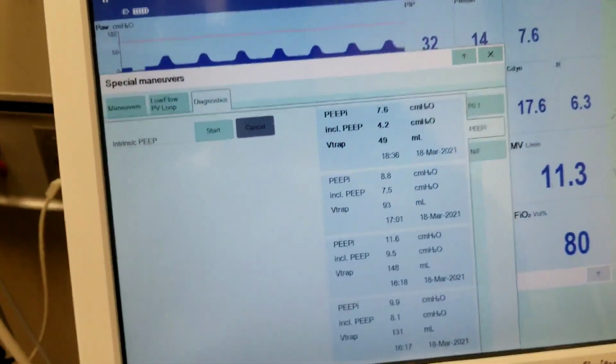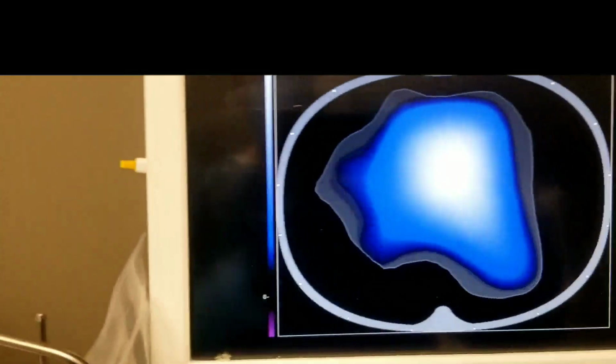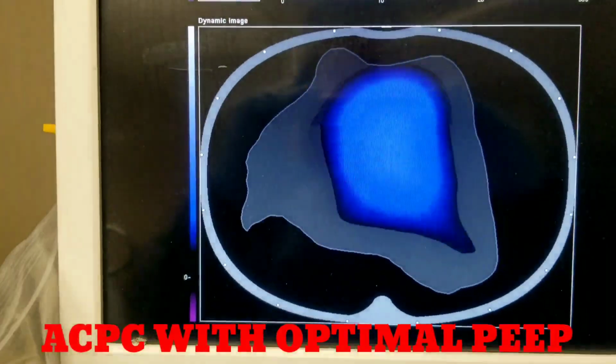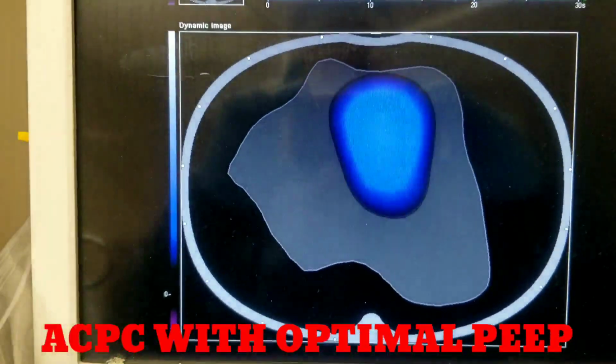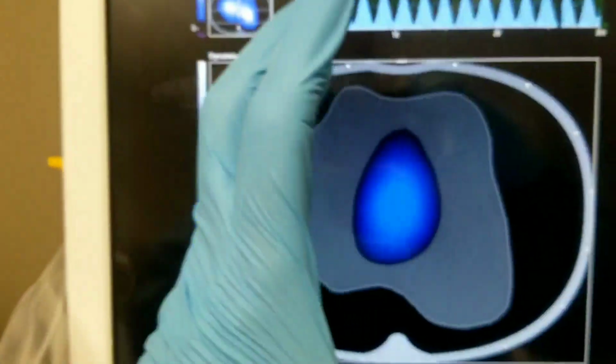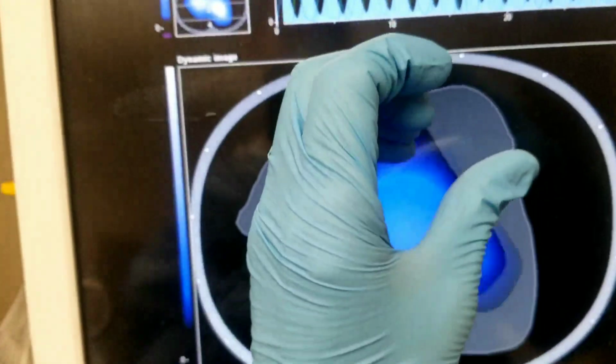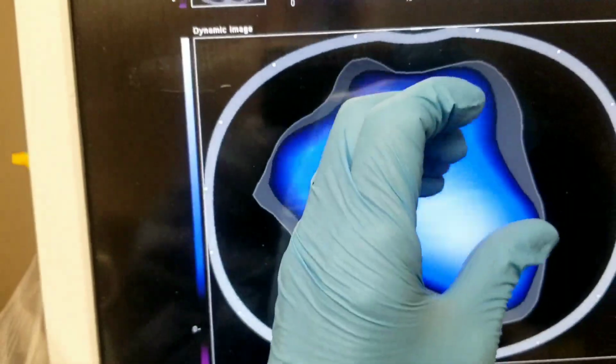We're going to set the patient on a rocuronium infusion. And if you look at here, notice the difference. See how the APRV was really hovering and splinting the lung open, and now on expiration it's going back. Right?